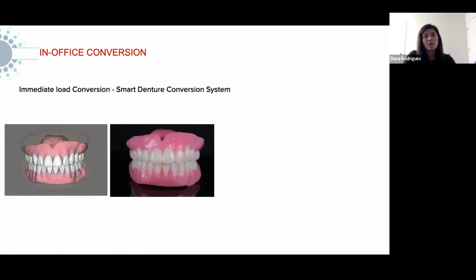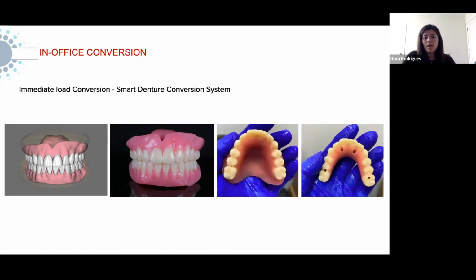So nowadays, 90% of my cases, I design my own dentures. I design, like I said, in split file. I do teeth separate from the base. I assemble together with Flexera. I use Flexera Smile Ultra. I never tried Flexera Smile. I don't know if there's a difference. I use the Smile Ultra and the Flexera base. I assemble both parts together, and then I use the Smart System for my pickup.